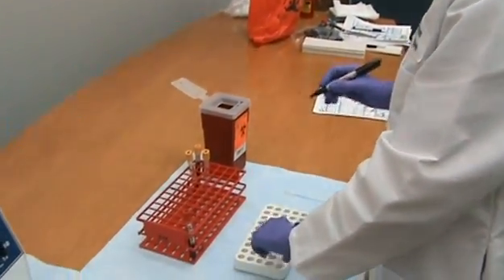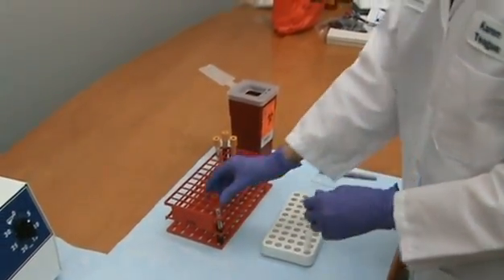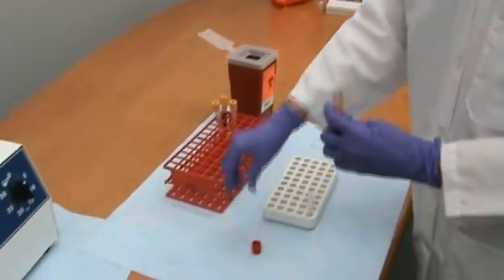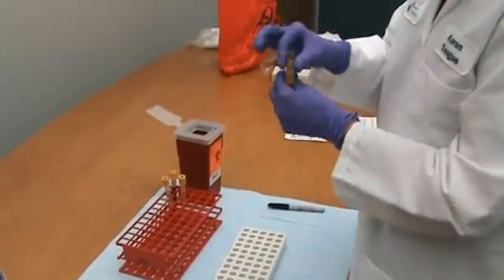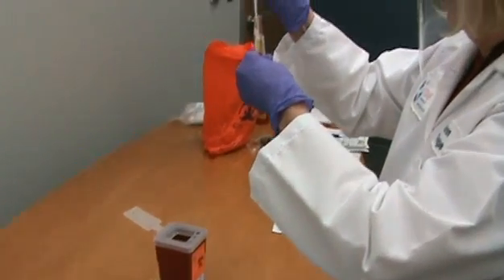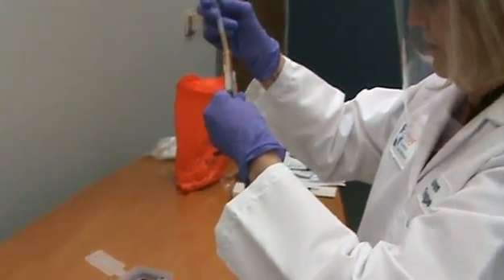Wearing the appropriate PPE, remove the stopper from the red top tube and place it on the absorbent pad. Using a transfer pipette, remove the serum from the red top tube, being careful not to disturb the clot, and dispense it into the appropriately labeled transport tube.